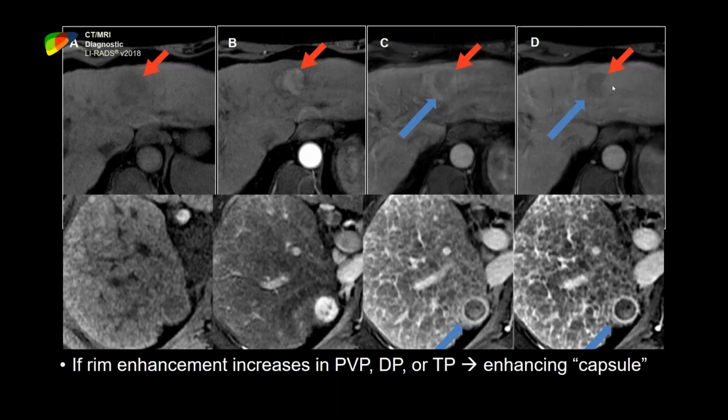I don't think that there's any scientific data that proves beyond any doubt exactly what the correlation is of lesion boundaries on MRI versus CT versus ultrasound. But my speculation is that the ultrasound size would not include the corona. Yeah, this is an interesting case. We will need to discuss this case, I think, internally within our steering committee.